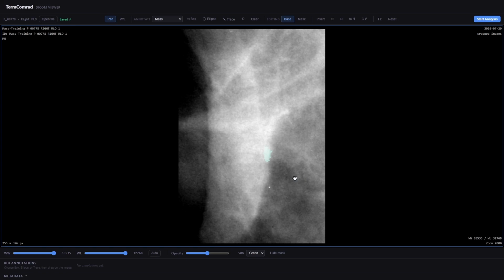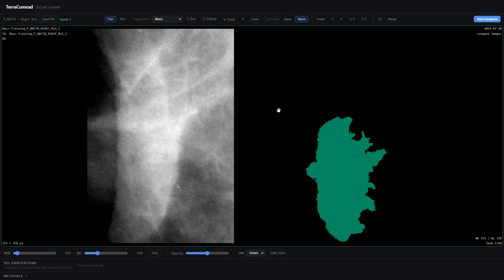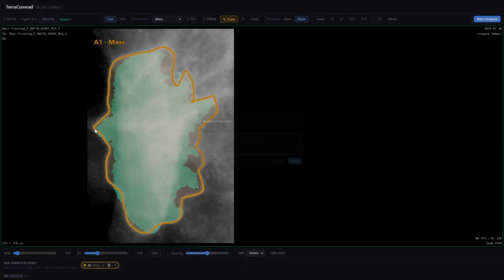This is our custom DICOM viewer that we have created. It has two main layers, called the mask layer and the base layer. Our main work here is to overlay the mask layer on top of the base layer, so that doctors are able to later on trace around the entire lesion or area of interest and take notes on it.